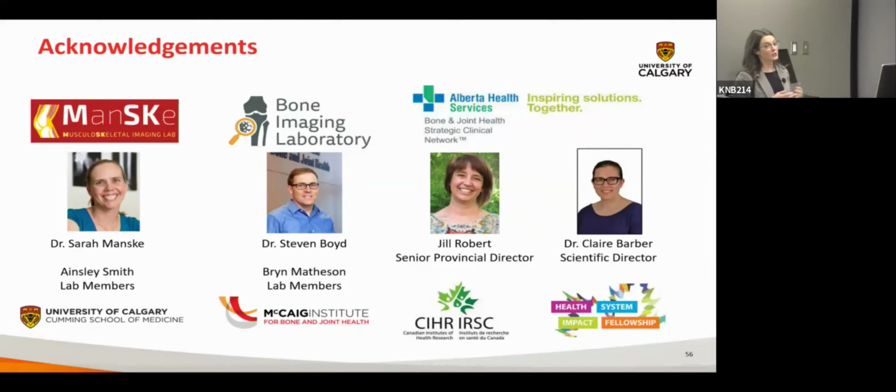Unfortunately, in the clinical setting, they just do not use phantoms. So my dream is that there would be a phantom in the bed, and then every patient that ever gets a CT scan, we'd be able to calibrate their CT scan, no problem. But unfortunately, that's just not what happens.